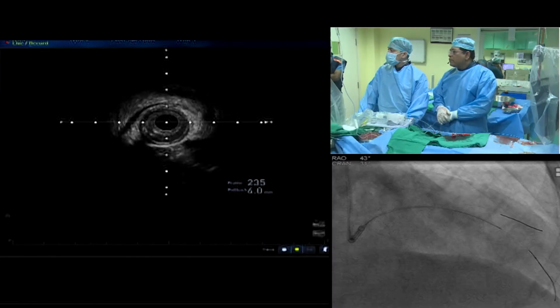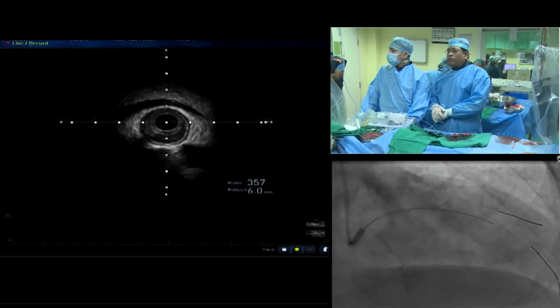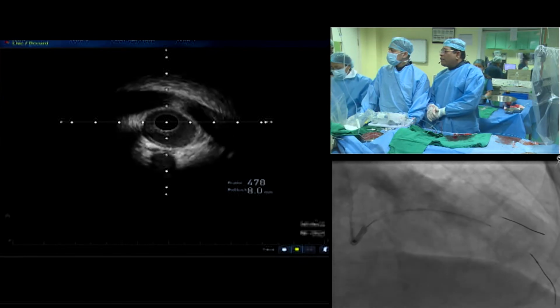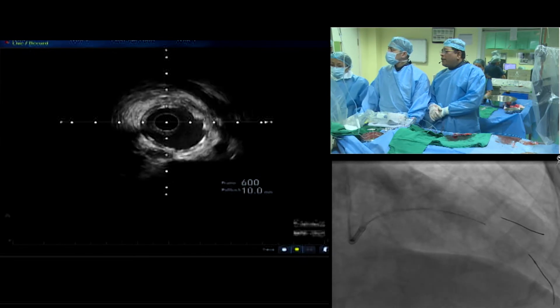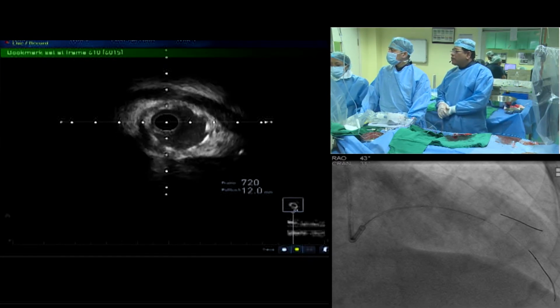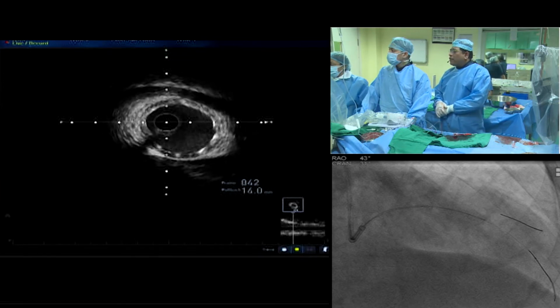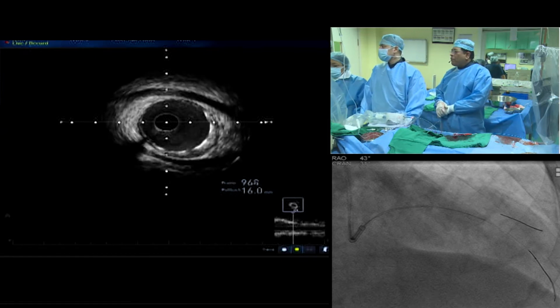Okay. So it is a diffusely diseased vessel. You see distally how pathetic it was looking. Now there is a good lumen here. Now we are approaching the stent. So the artery has grown a little there also. It's okay. So the distal segment also will give some, okay, 3. Now you see, now it looks good.